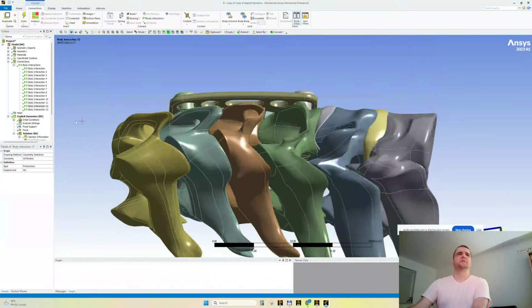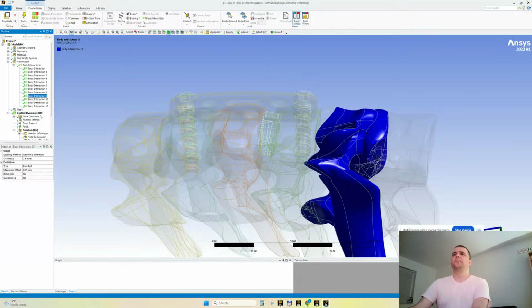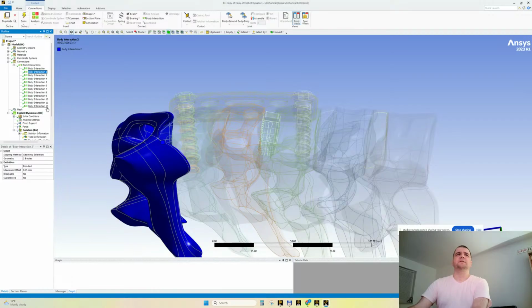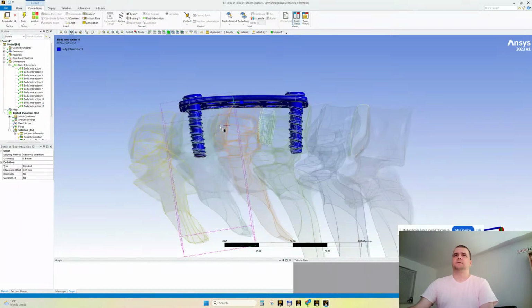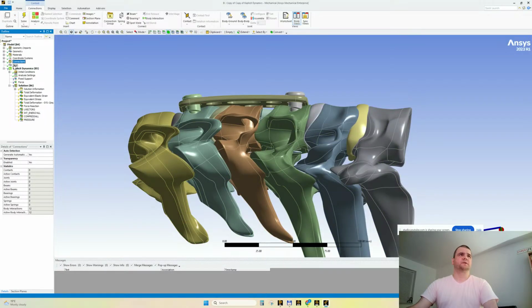Oh, what is this? So, yes, in here, let's rename it to 12, for the sake of conformity. Yes. Everything is kind of nice. What I wanted to say is, let me modify this to 0.2, maybe. We do have connections, I have mesh.